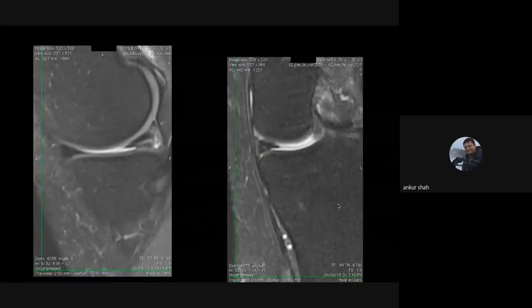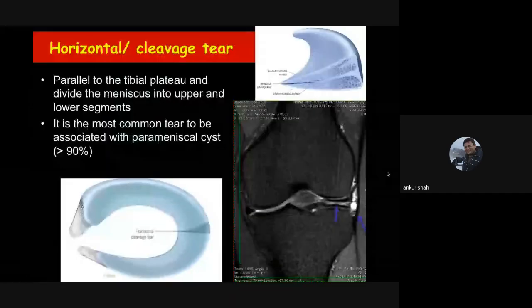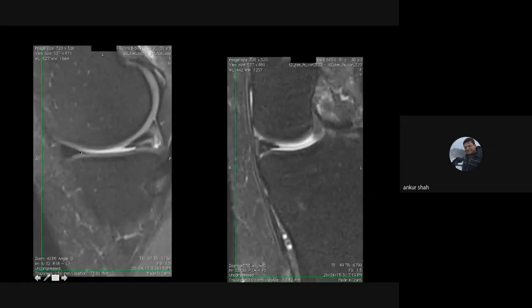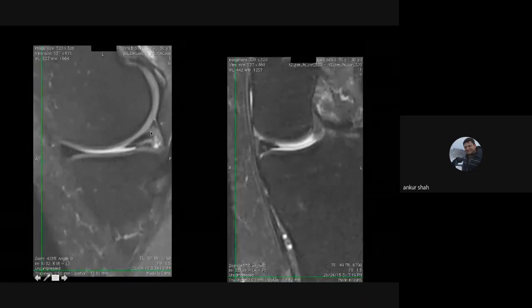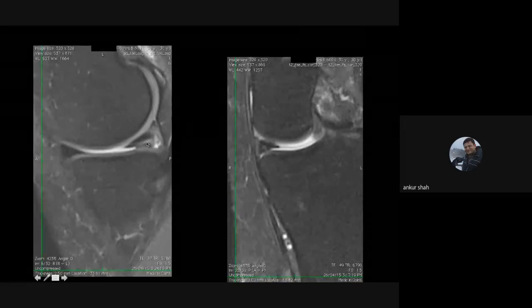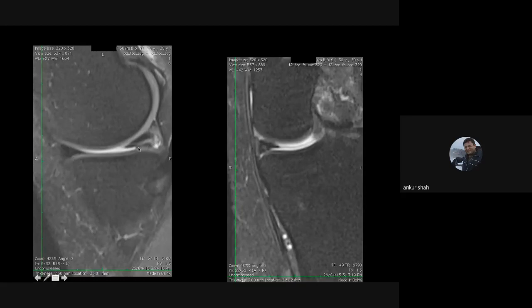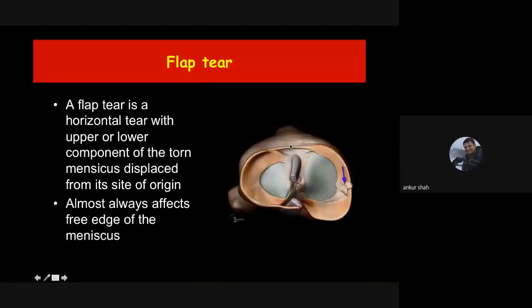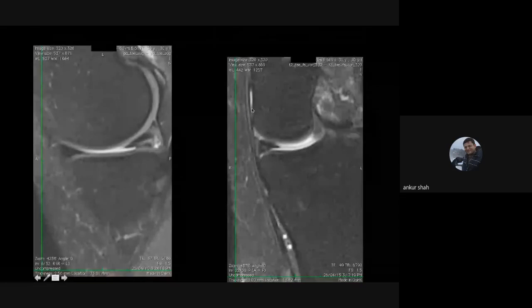The second criteria for meniscal tear is abnormality of shape. If the posterior horn shows a broken triangle with a small fragment missing, this abnormality of shape almost always indicates a meniscal tear, confirmed on coronal images where the triangle is missing and a small fragment is torn and displaced. This is known as the flap tear — a part of the meniscus is torn and displaced, most commonly into either the meniscofemoral or meniscotibial recess, or even into the intercondylar region where it acts like a loose body.